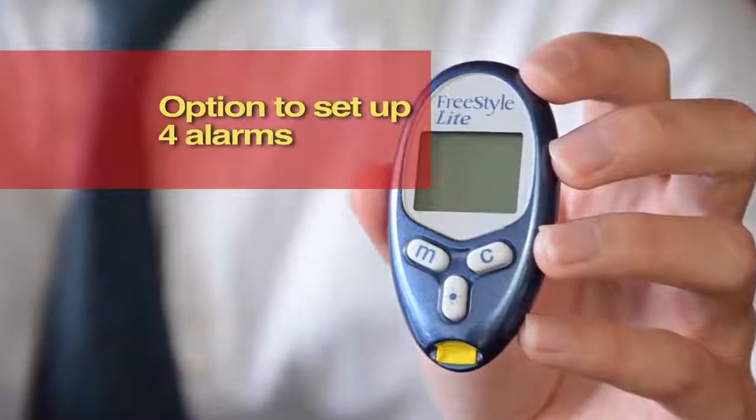This would be convenient for someone who does not bleed very well or if someone has taken the blood sample away from the test strip too early. And it's also cost effective because you do not have to discard that test strip and start with a new one. There's an option to set up to four alarms. This function would be handy for someone who is testing their blood glucose several times each day, and it's ideal for someone who is injecting insulin several times each day. It's also a great reminder for someone who is very busy or has difficulty remembering to test their blood glucose, or someone who takes their medications around testing time.